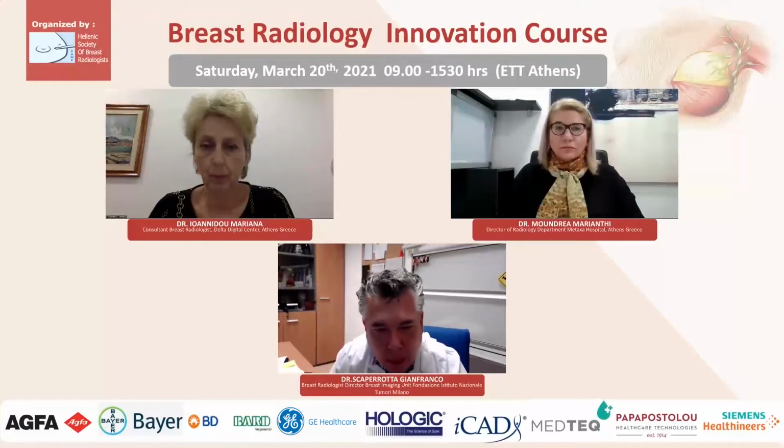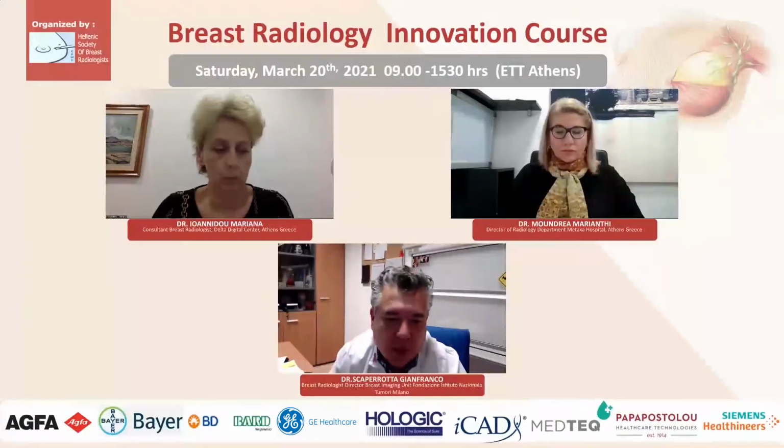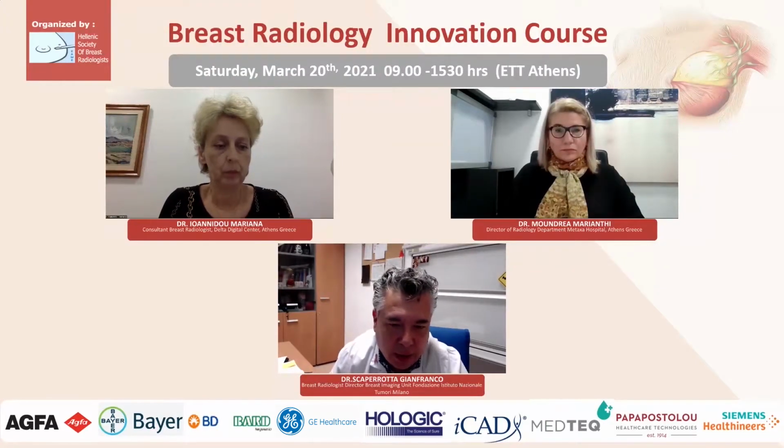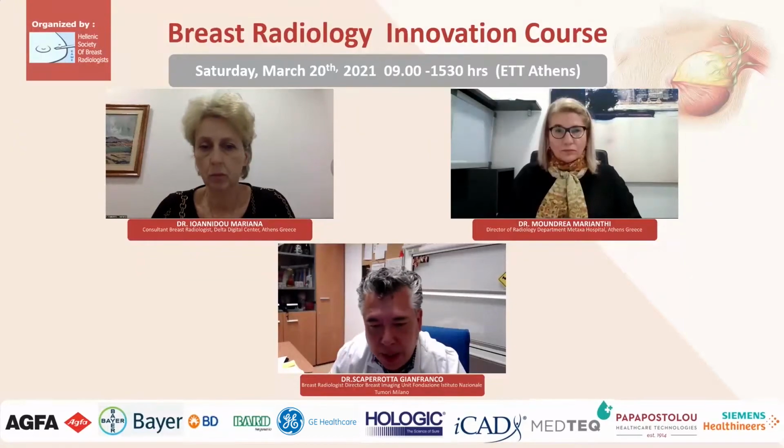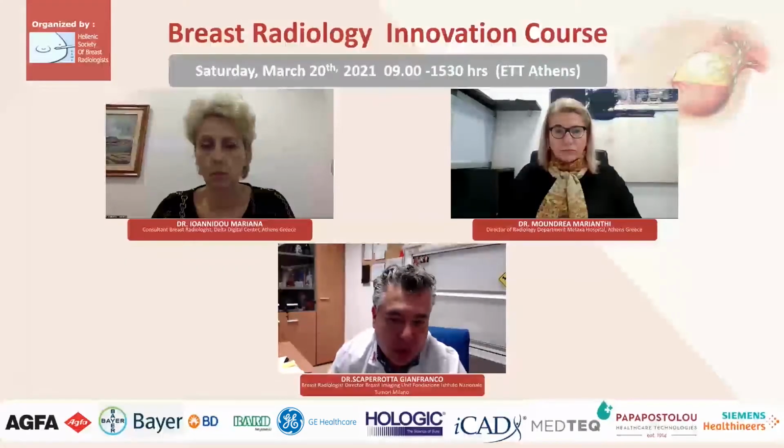No, we use the biopsy. Generally, in our experience, for example in BI-RADS 4B or 4C, where we don't have enhancement, we use the biopsy the same.